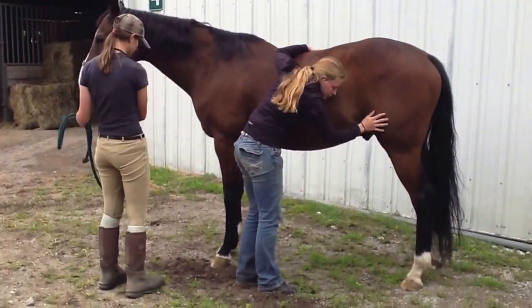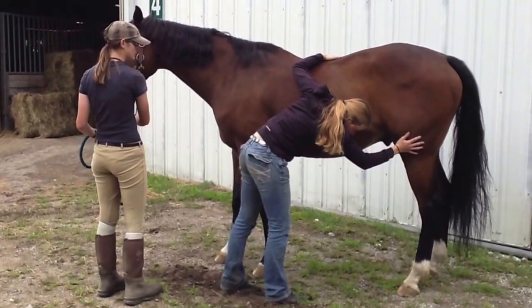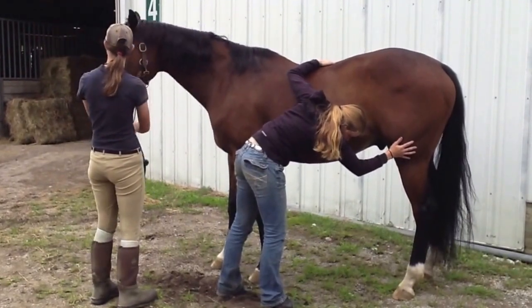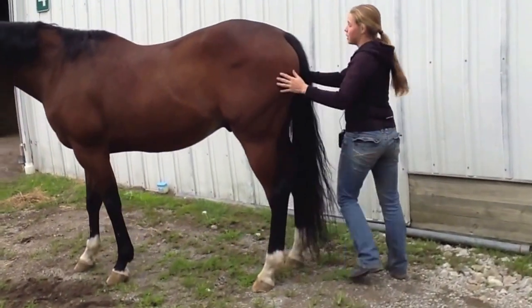So I heard some gurgles there. There's some gurgles there as well. I'm going to scooch his butt over, Katie.